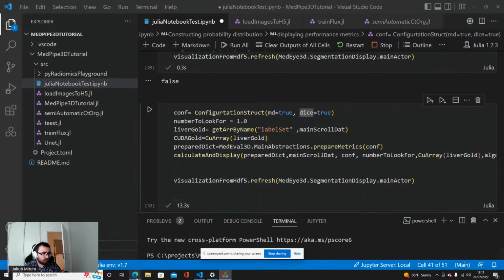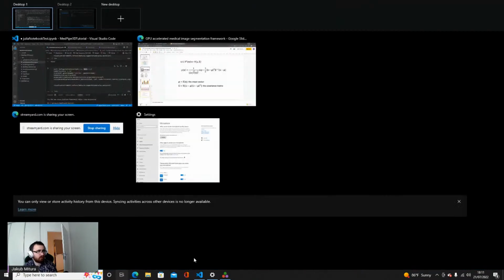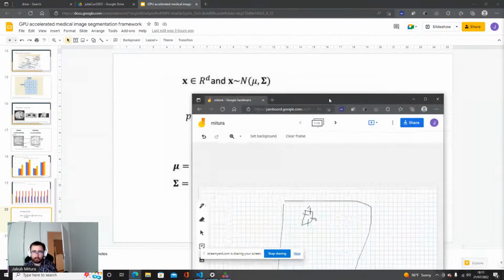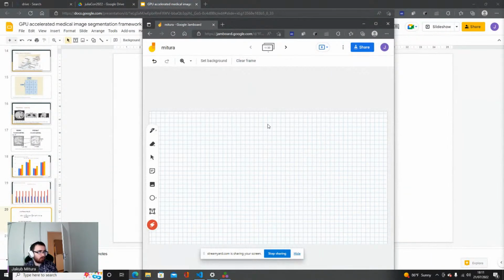Now, just to get back to the idea about the metrics and what these different metrics measure. What is so special about medical imaging that it needs some specialized metrics?